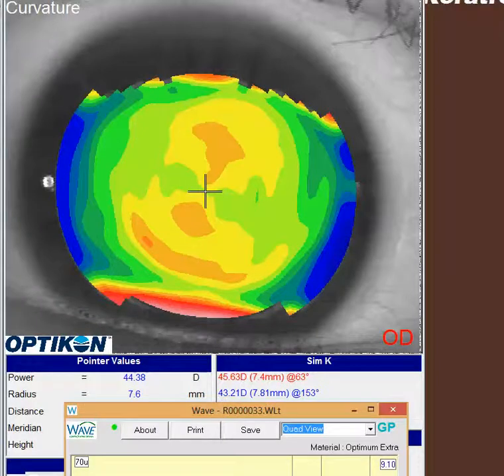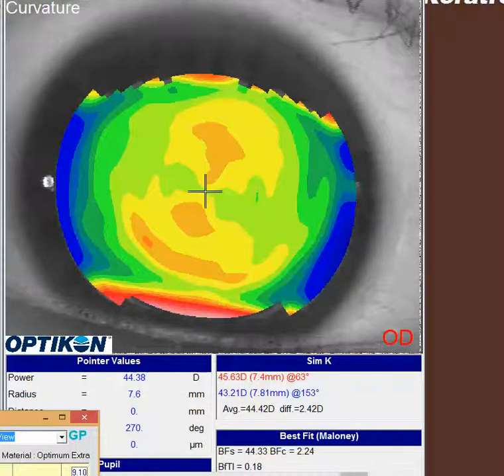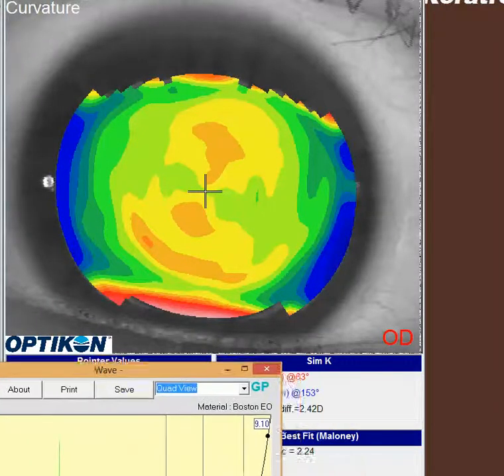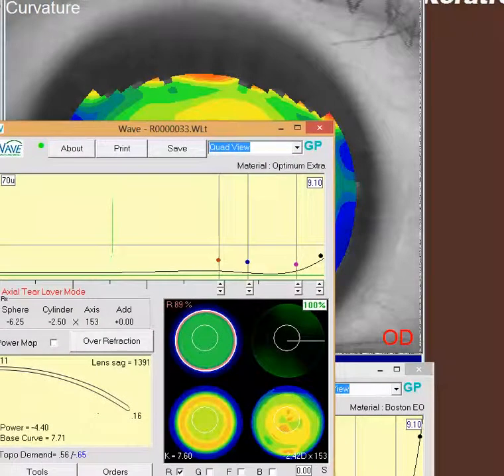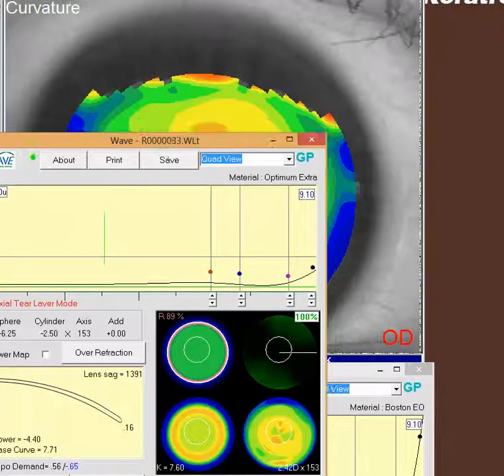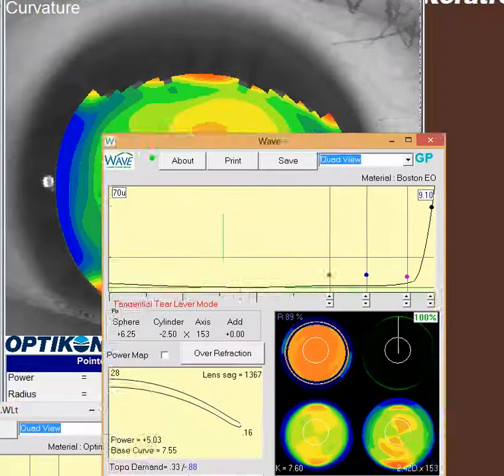The best way to do that, what I find helpful if I bring up a design, I notice when you first opened up this original design of yours that you average the corneal astigmatism. And that kind of smooths out the areas of transition here. I might recommend that you don't average the astigmatism to give you more true corneal representation.